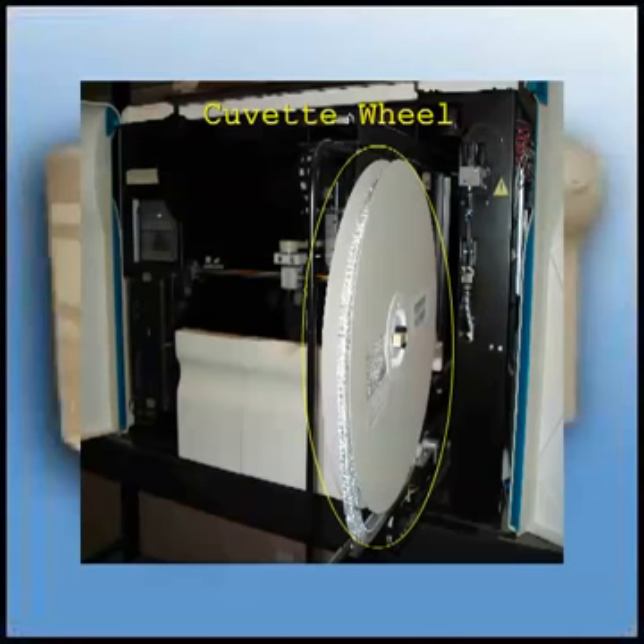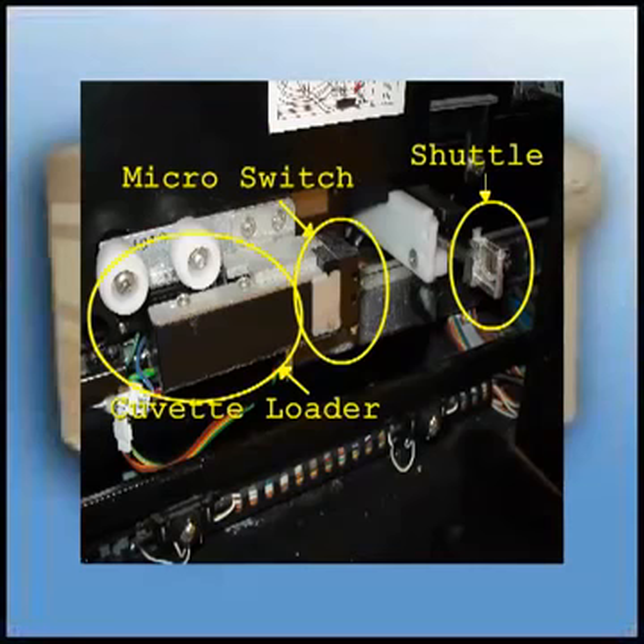The cuvettes are placed into a shuttle by the cuvette loader. The shuttle then moves the cuvette through the measurement block. In addition, this is where you find two micro-switches. One micro-switch tells the unit when a shuttle is in the loading station, and the other micro-switch indicates that a cuvette was loaded into the shuttle.